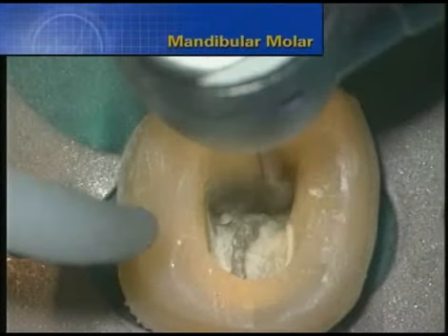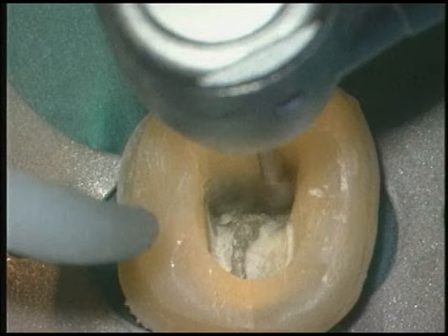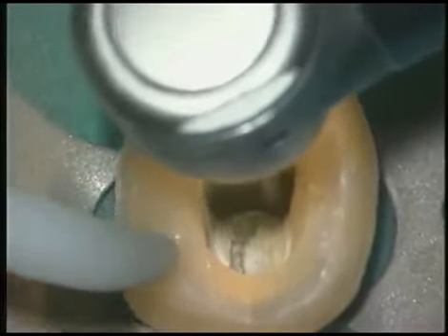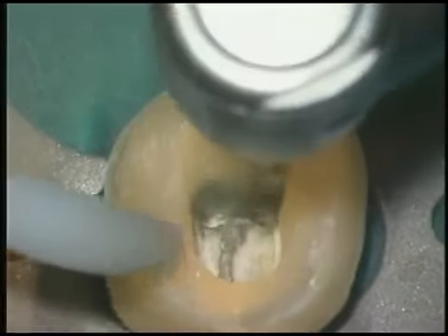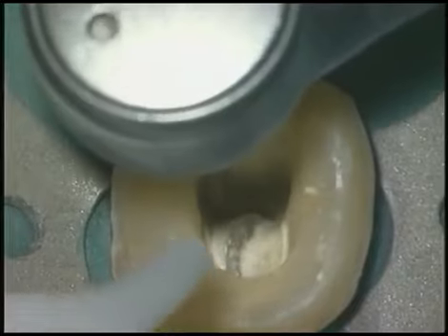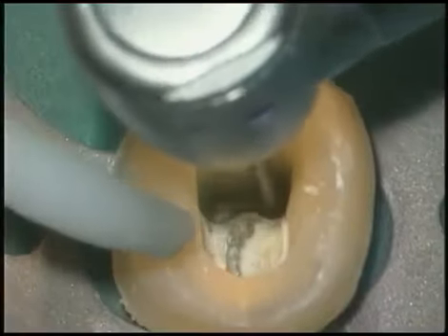In this mandibular molar, we removed the clinical crown to improve access. A preoperative film revealed a deeply positioned, broken instrument around the curve and close to the furcal side concavity. There's been a continuous discussion about the importance of great coronal and radicular access. Gates-Gliddens and diamonds are used to establish this access. Larger GGs are used to face off the orifice. That allows us then to bring in tapered diamonds, and we can flare back the mesial axial wall. This will improve our access into the middle 1/3 of the root.